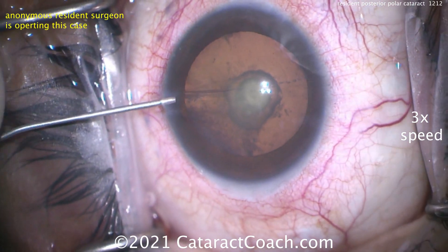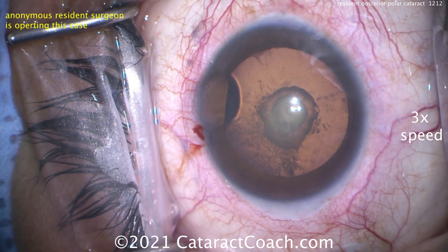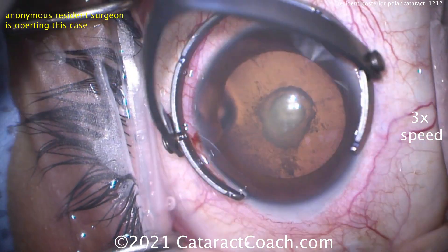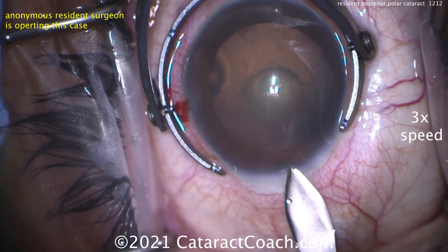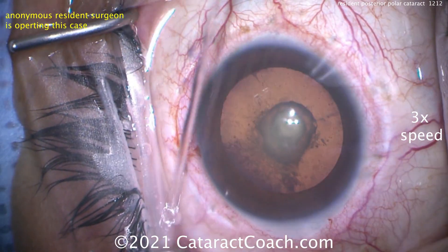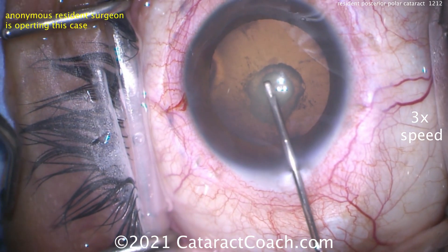We're showing the video at three times normal speed because it's a resident video and we want to see the whole thing, but we don't have the patience to sit through a 20-minute video, so we'll get it done in about six and a half minutes. Let's see the main incision being created here — that's looking pretty good. Now the rhexis has to be accurate. This has to be a 5mm rhexis.